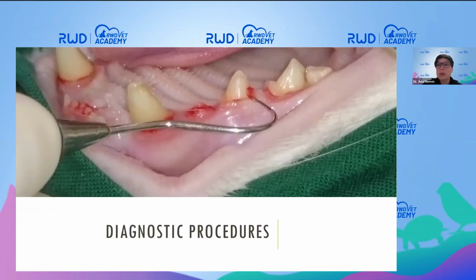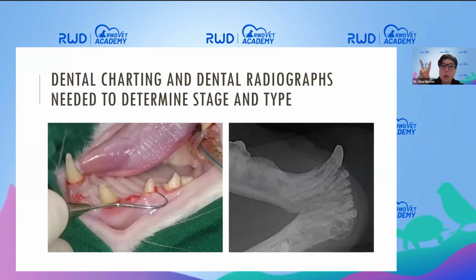Okay, so what can we do clinically for our patients? How will we diagnose tooth resorption correctly? So absolutely the two most important things, the first is our clinical examination. For clinical examination, we would use a dental explorer and run it along the gingival margin perpendicular to the tooth. By doing this, we are looking for lesions that are there. And we have to discern furcation basically from tooth resorption.